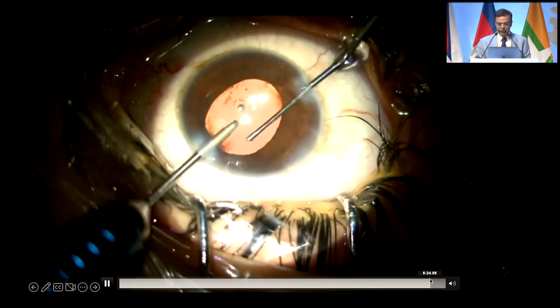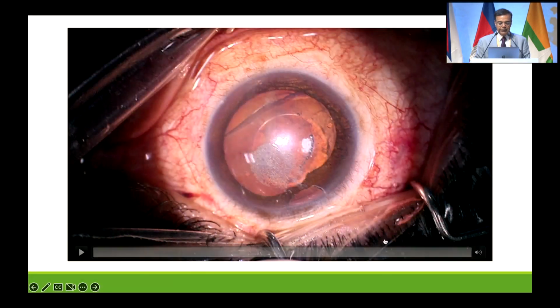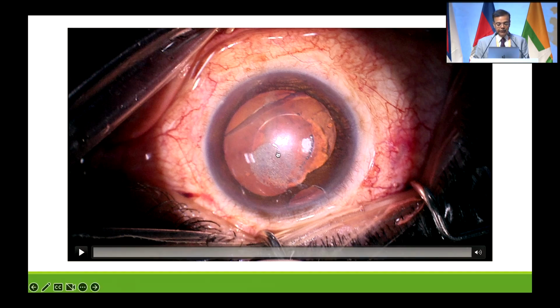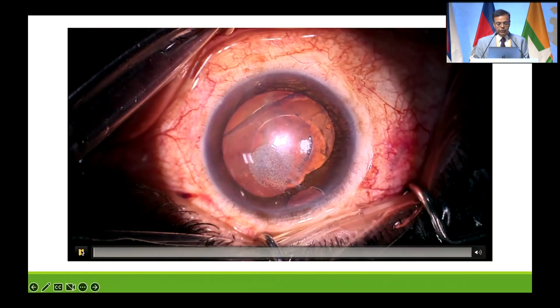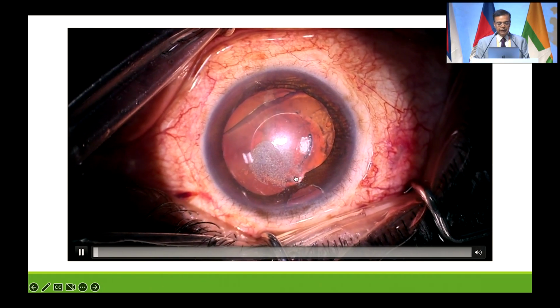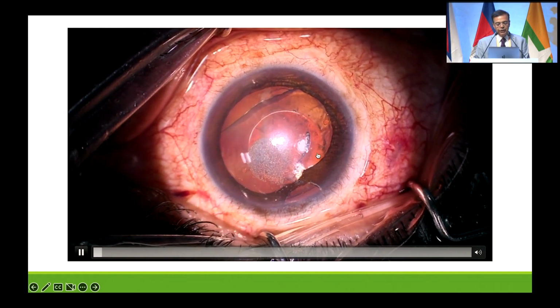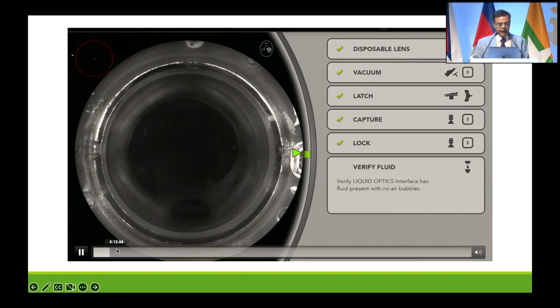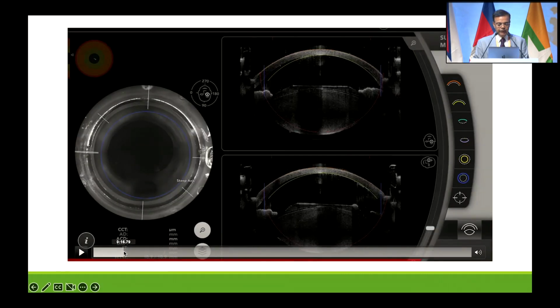It's fairly straightforward. Now, this is another patient who was with a phakic lens many years old, and I'll finish very quickly now. Underwent a VR surgery, and following the VR surgery, following the SOR, this lady developed a cataract and now needs a cataract surgery. So you can see the silicone oil bubbles here, and we thought that we would prefer a femto-assisted capsulotomy here, and went ahead with the usual way that I showed you.